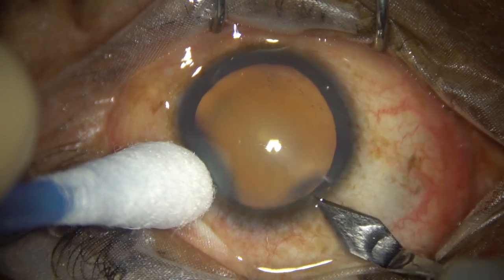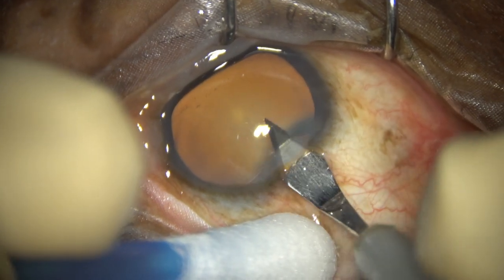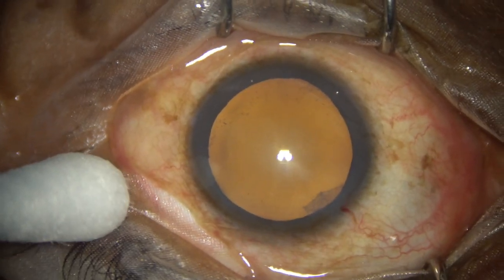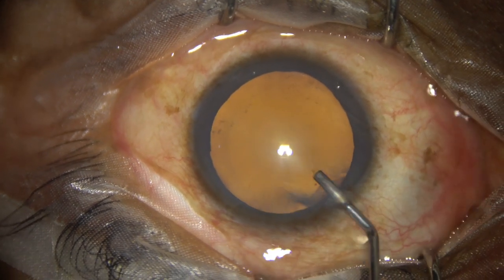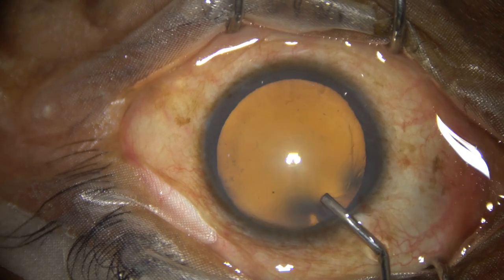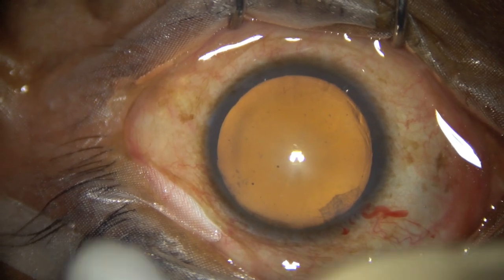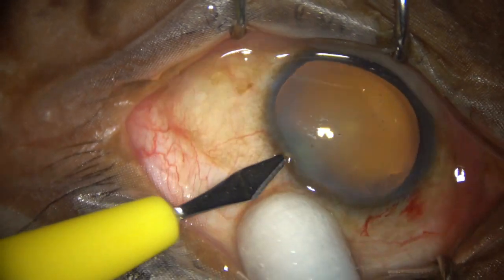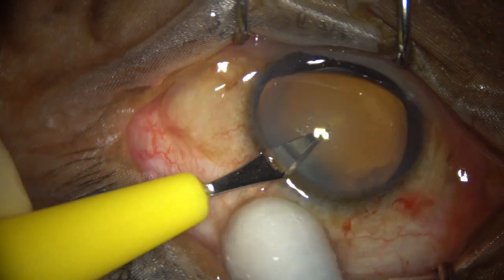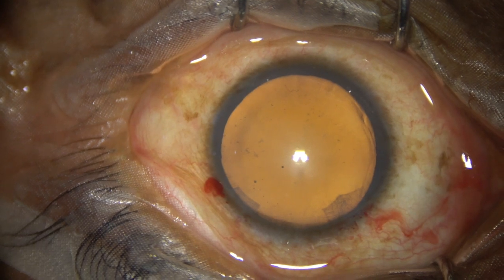This is the main incision with a 2.8 mm steel keratome on the posterior aspect of the limbus. Now the anterior chamber is filled with 2% hydroxypropylmethylcellulose. Then one side port is made on the left side of the main incision, about 2.5 clock hours away.